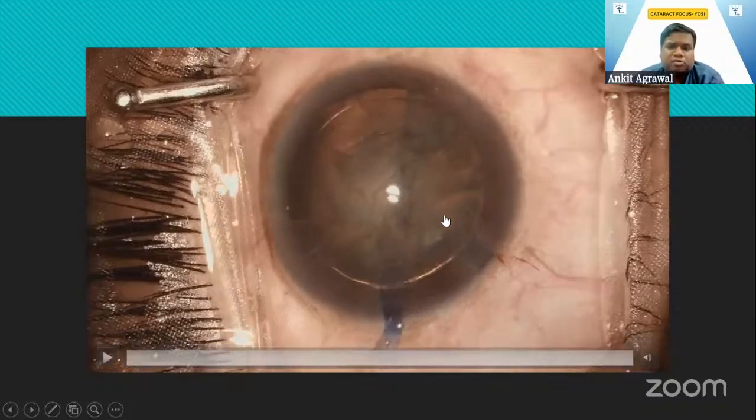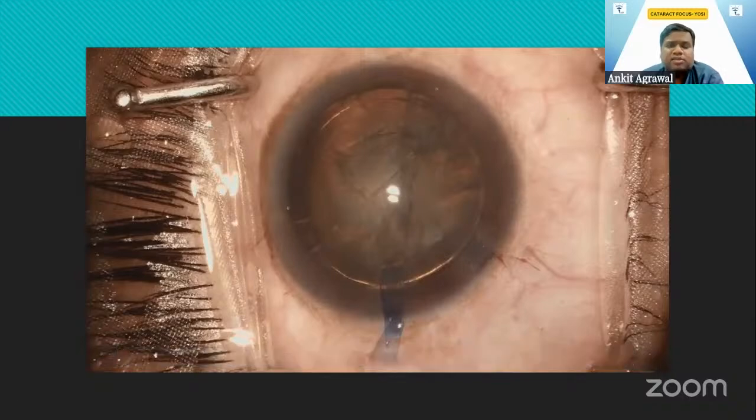While doing this procedure, continuously keep pressing the nucleus after every 0.1 ml of fluid injected in the eye, because that way you will remove the water which has gone behind, and protection from the capsular blowout is there. I will explain about it in the later slides.